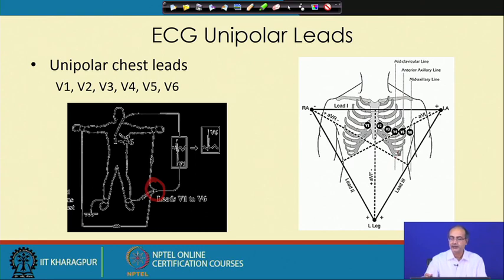This is a very important point, and nowadays a number of channels are connected, and you get all of them, and some of the machines come with automated features where the machine itself can suggest which signals are probably not normal.